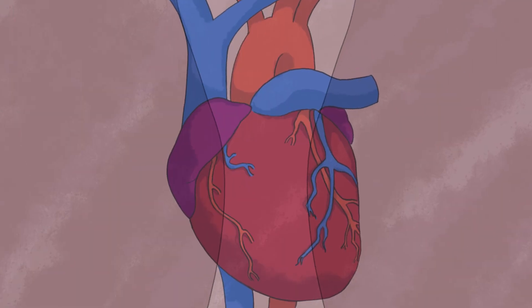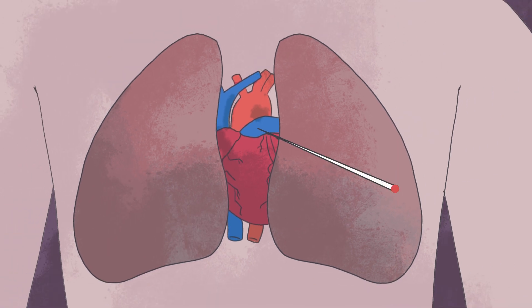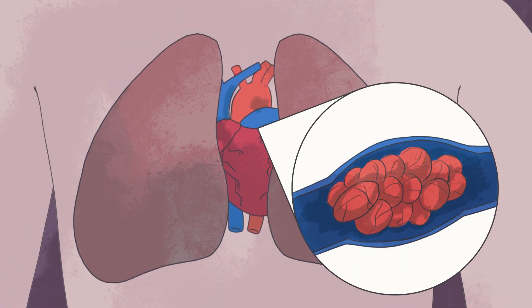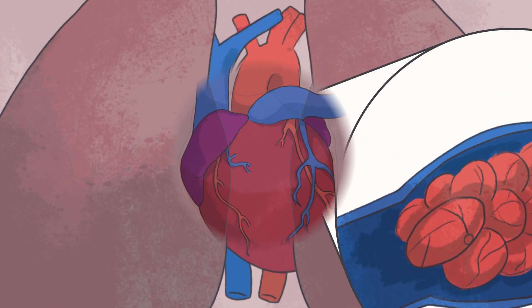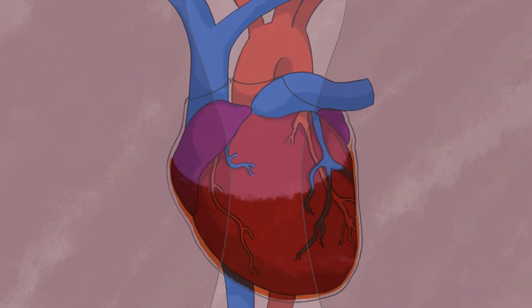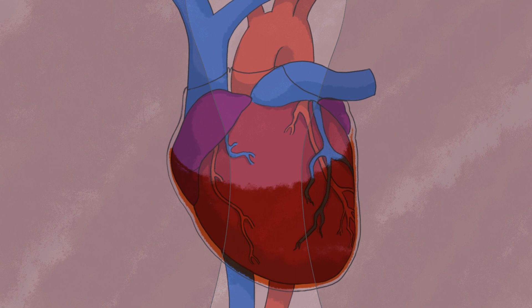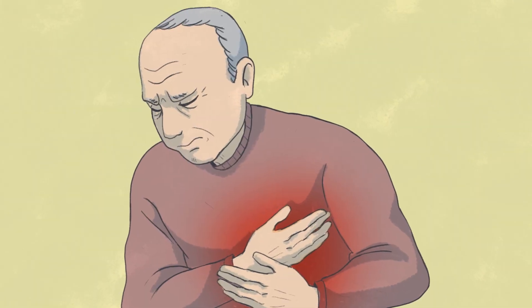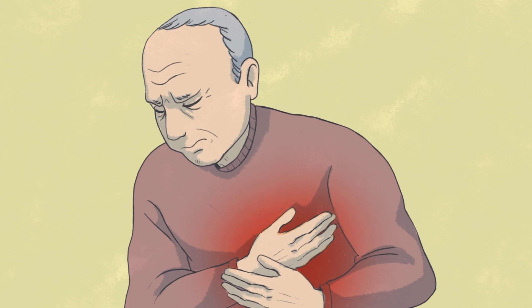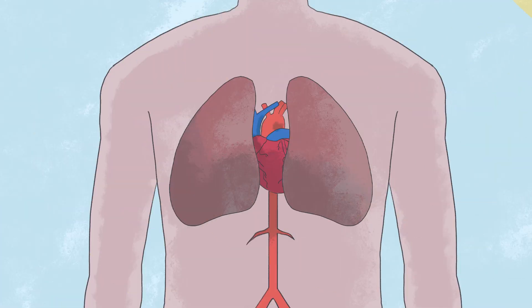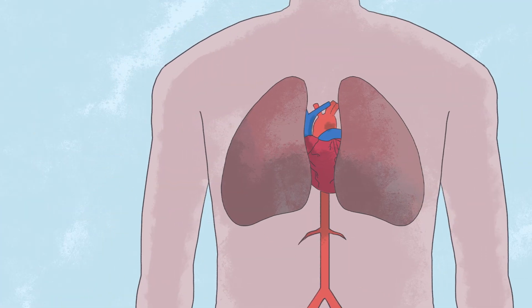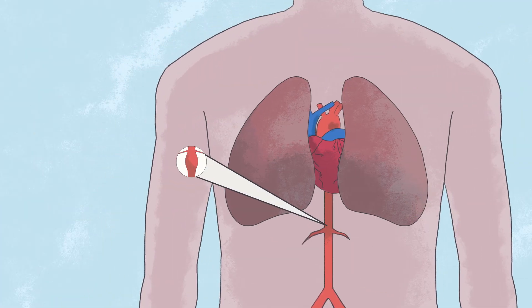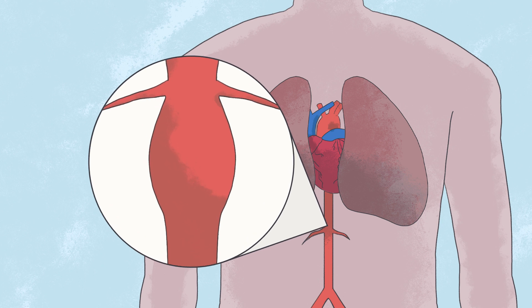Here we have a CT of the heart from a study looking for pulmonary emboli. The pericardium here is high attenuation — this is a hemopericardium, or blood in the pericardium. This patient was having a non-ST elevation myocardial infarction. Hemopericardium can also occur with other conditions such as aortic dissections and malignant pericardial disease.